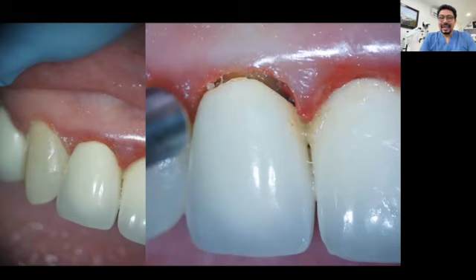We can see some cement in between the crowns. The patient wasn't able to even clean that area. You can see that the crowns are not properly adapted. And all these factors were generating the pain and the discomfort in the patient. So the reason for the patient's complaint is not related to endo. It's related to a periodontal disease that is being provoked by the crowns and by the excess of cement that is still in between. So what to do?